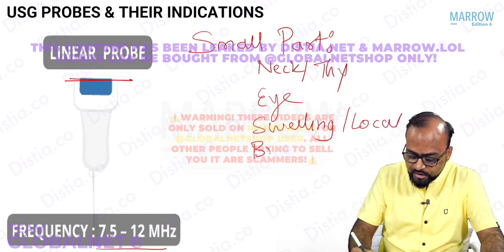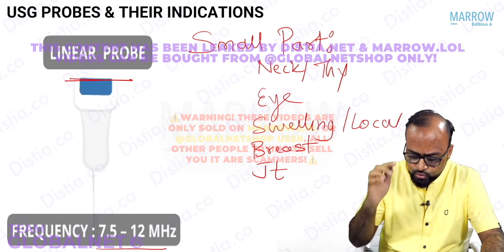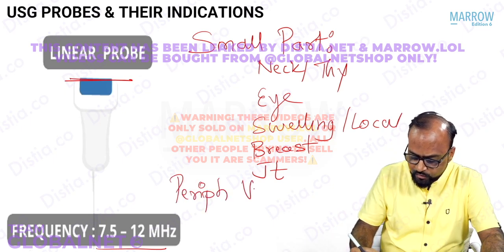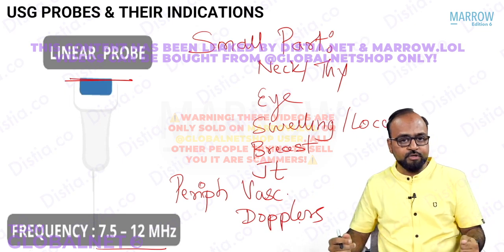So for breast ultrasound, for almost all joint ultrasounds, right? This is used. This is also used for peripheral vascular Dopplers.